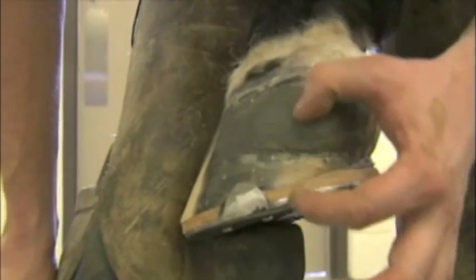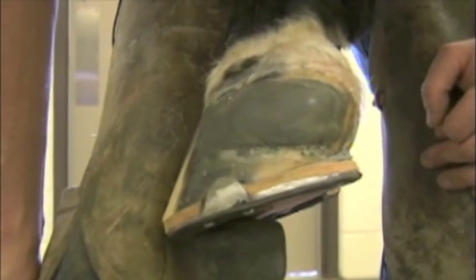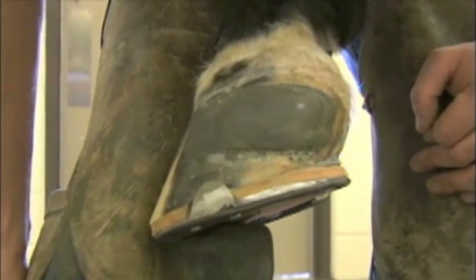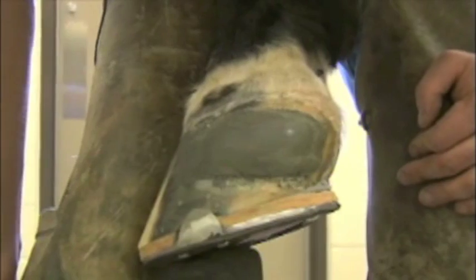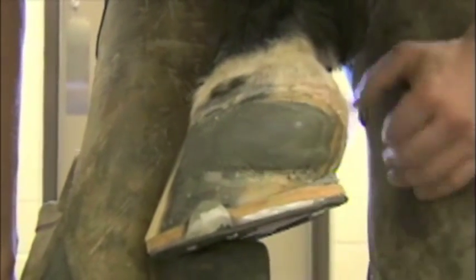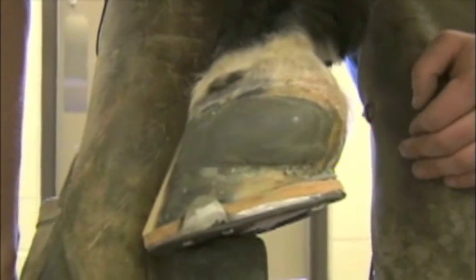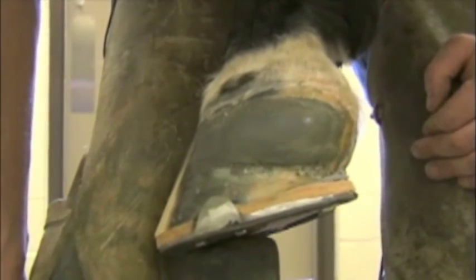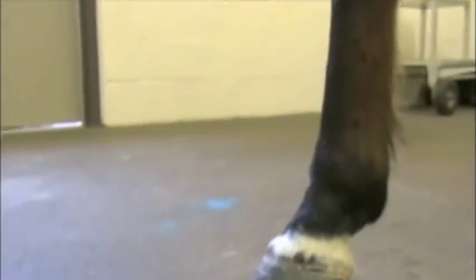I leave that patch on until it grows down and I trim it off. If it gets loose, sometimes it has to be redone in a couple of shoeings. Otherwise I leave it on and trim it out with the normal hoof wall. Once this quarter crack is about a quarter of the way grown down, I don't even patch them anymore — I just pull the patch off and leave it off. Once it's out of the corner with a good half inch or so, they don't really need patching anymore. That's pretty much how we patch a quarter crack with Equilox and fabric.